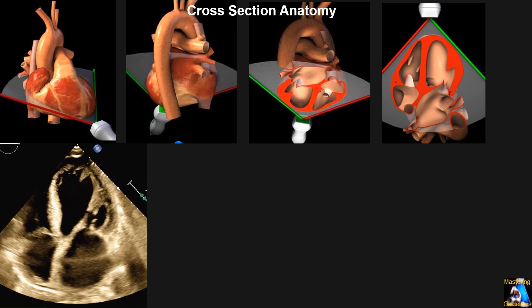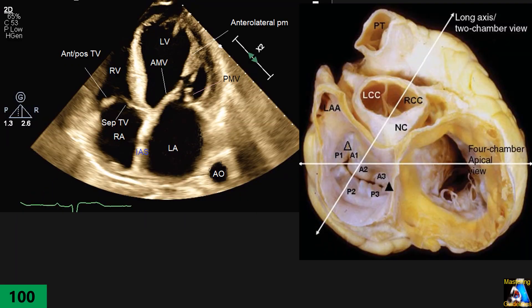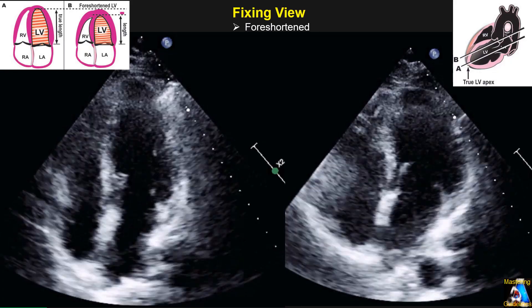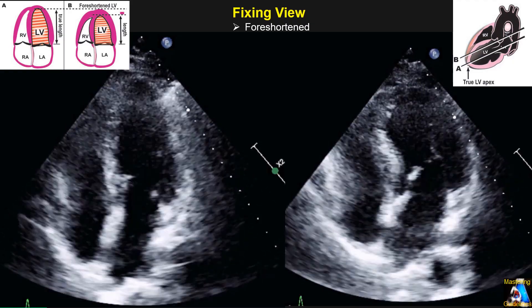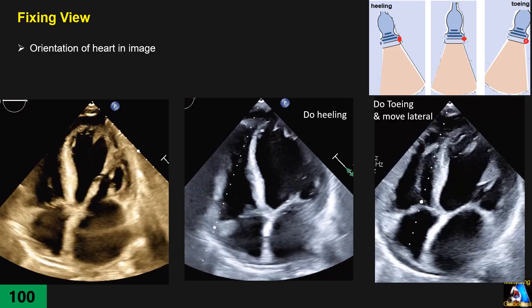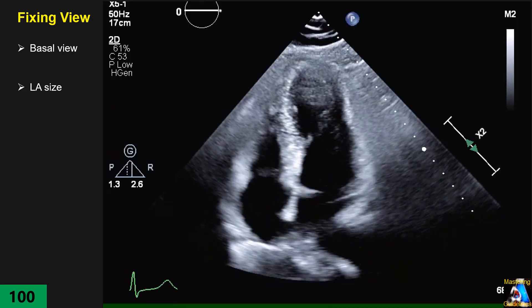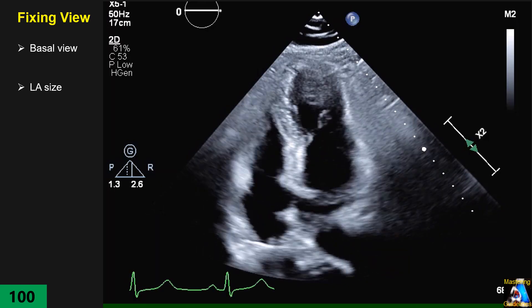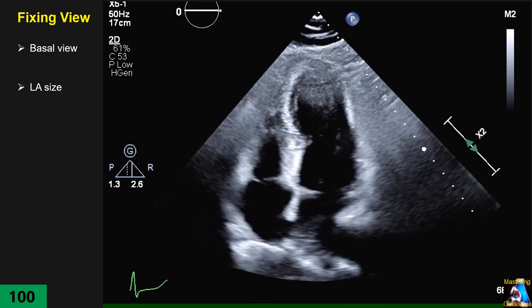You will learn the cross-section of the heart, how to name those structures and the plane of the image, how to fix the view when you are foreshortening, how to know when you are foreshortening, how to fix the orientation of the heart under your image, how to know your basal view or not, how to fix the left atrium, and what the problem is with that.